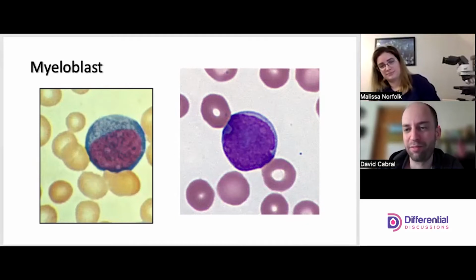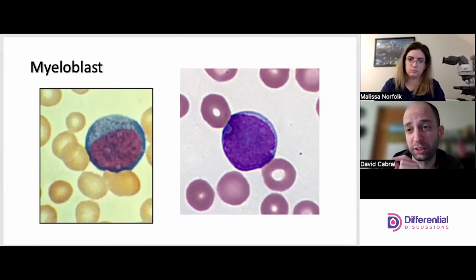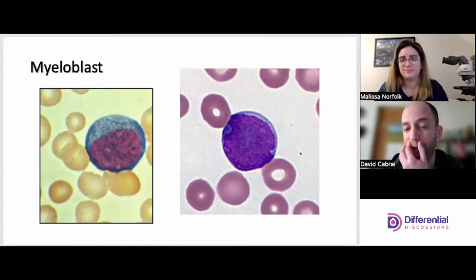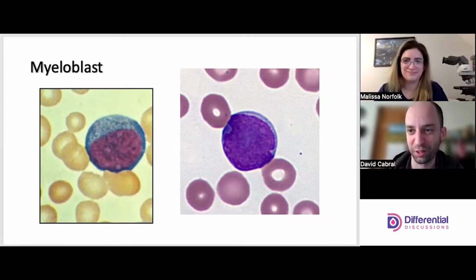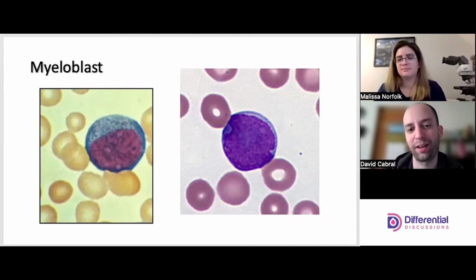But the main thing would be the chromatin pattern. But first, let's touch on the cytoplasm. Typically a blue cytoplasm, right? So kind of boring there. It's the nucleus where the defining characteristics are. There's lots of different words to describe the texture of the nucleus, and certain terminology might connect more with different people, so teaching with the terms is tricky.